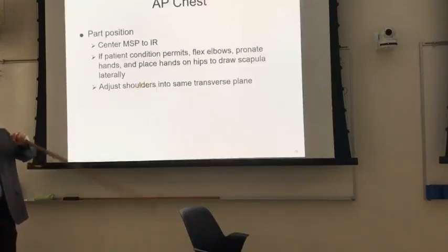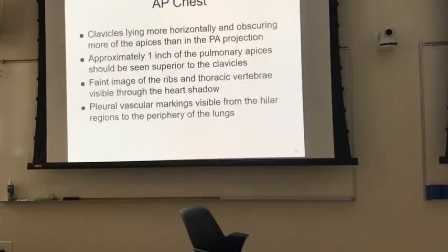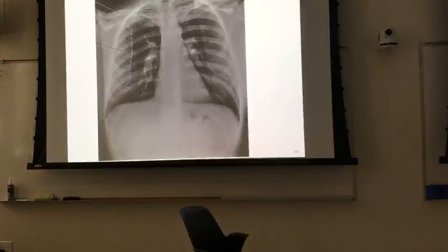So make sure that you get the arms out of the way, even if you don't rotate the shoulders forward. All right. So that's a little bit lordotic. The clavicles are a little bit high, but depending on really, I would be hard pressed to reshoot this without a radiologist pitching a fit about it, and I think a radiologist would be hard pressed to pitch a fit about this X-ray.